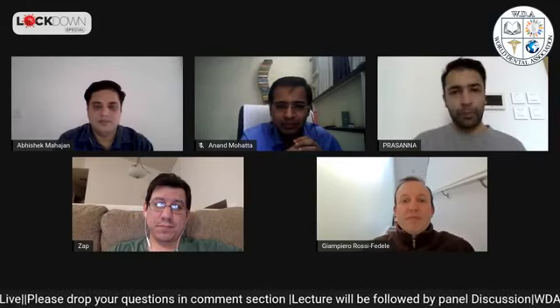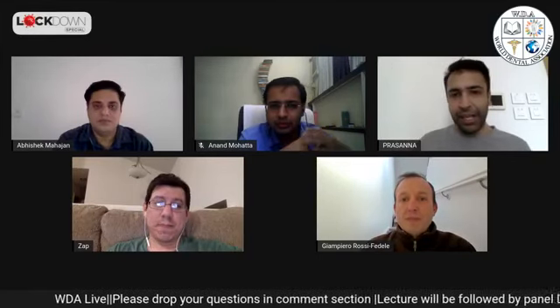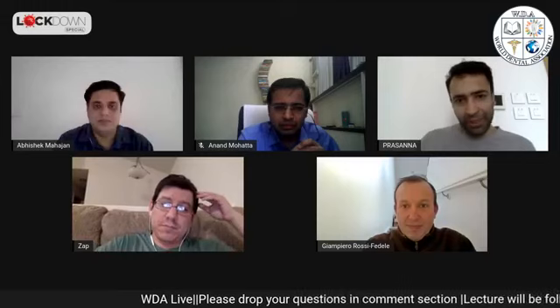Correct. I mean, with regards to PDT, if at all I see a commercial variant coming up soon, of course, we have a commercial variant already from a company called Photosan, but the research base for Photosan is rather weak. There are not many studies done with their chemicals. So if at all I see a robust protocol coming out of photodynamic therapy and a commercial availability, it has to be the Chitosan Rose Bengal combination from Kishan's group, which means that we have established protocols based on his papers, depending on how much time you activate, what kind of light you use, and so on and so forth.